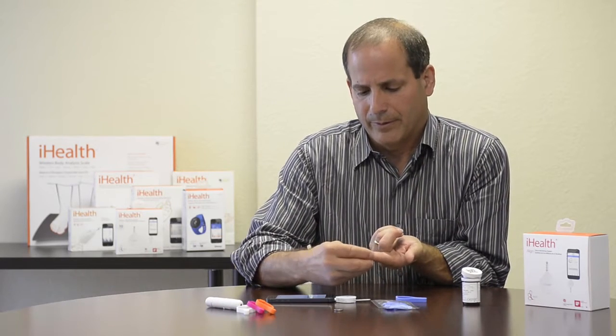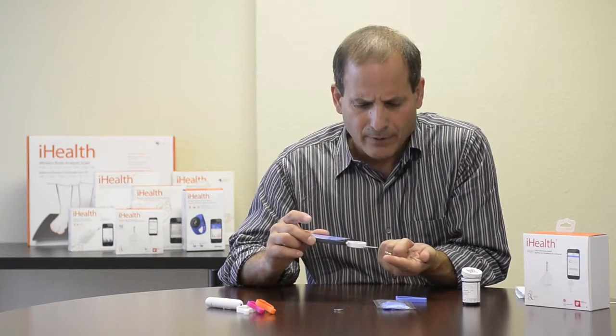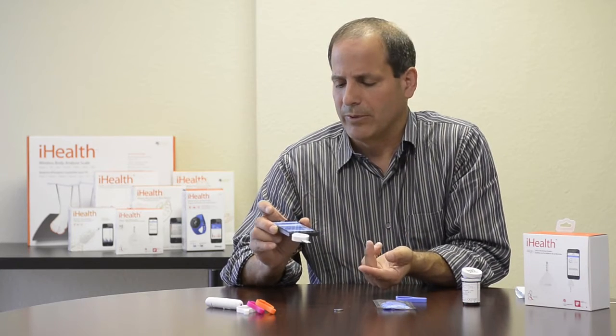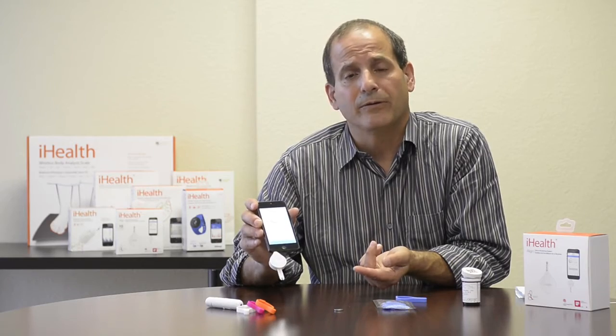Once I get my blood drop in position, I'm ready to take a reading. I just touch the tip of the test strip to the drop of blood, and within seconds my reading displays on the phone directly.